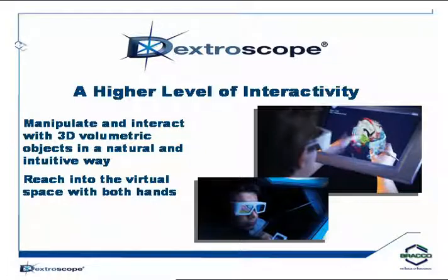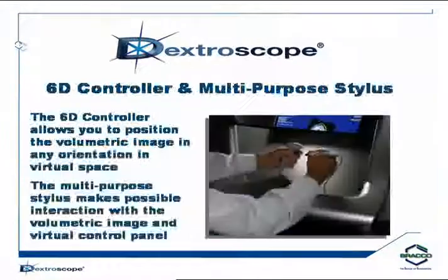But tonight you will not be wearing these active 3D shutter glasses. You'll be wearing polarized passive glasses because we have a left eye and a right eye projector there for you. So this is passive, but while you're in the environment, you're wearing active glasses.